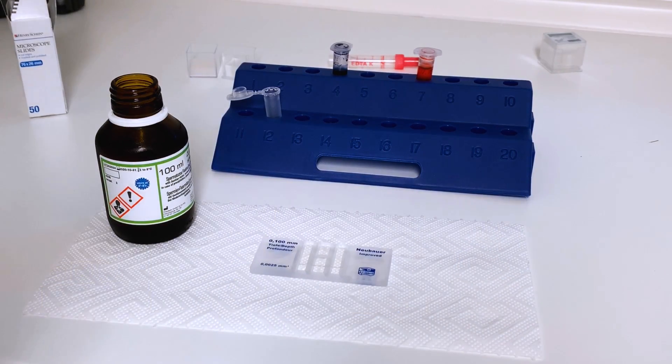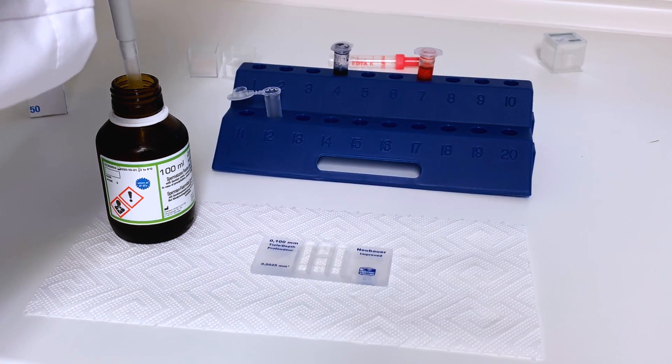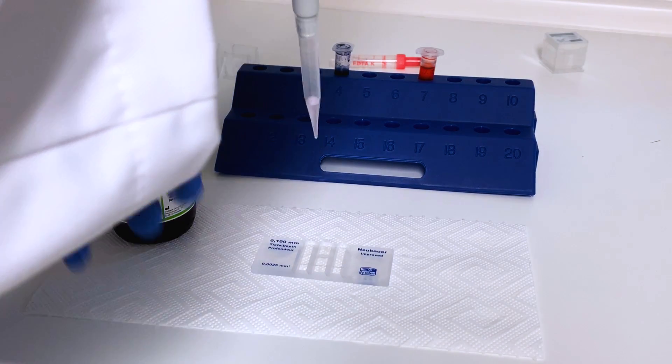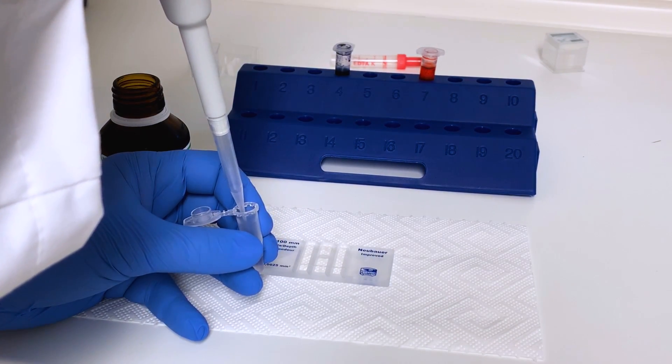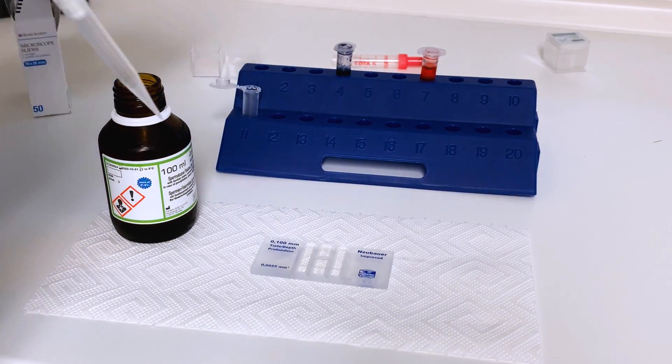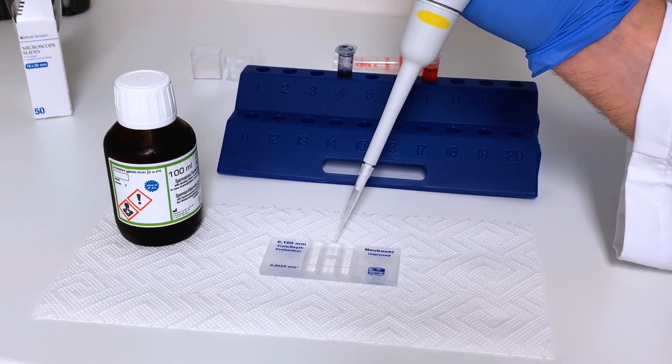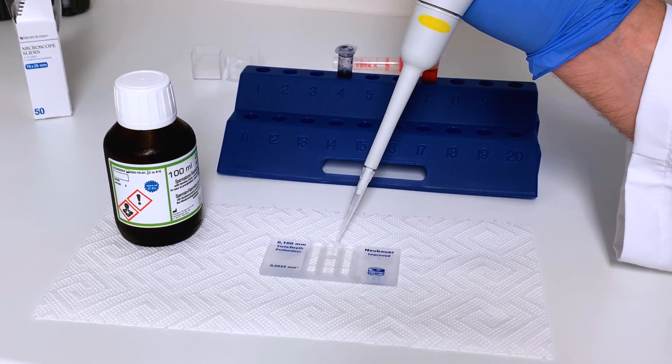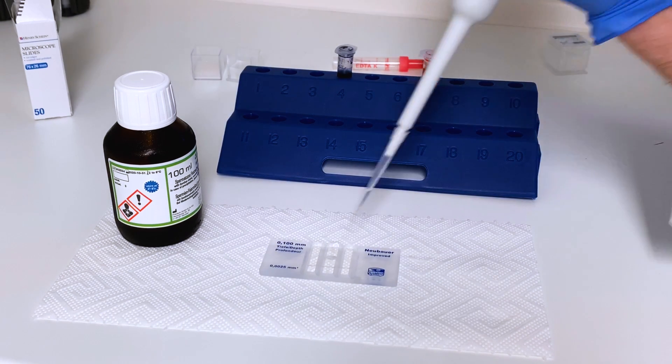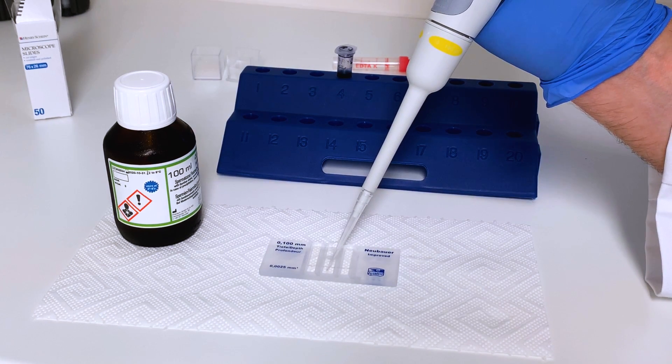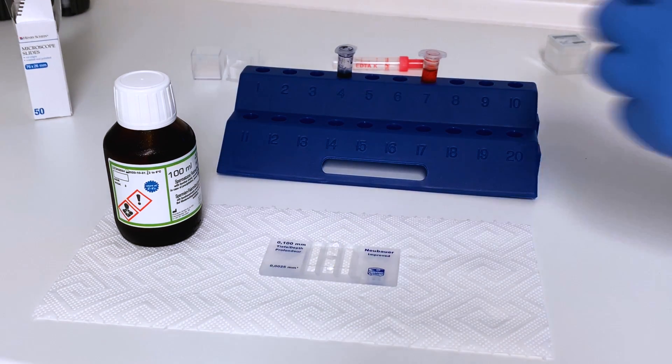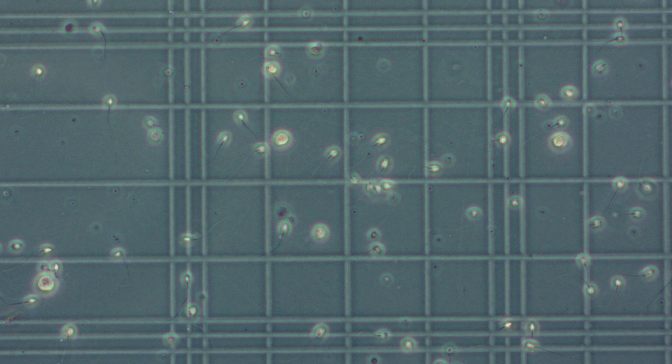Before starting the counting process I have to dilute the ejaculate and this is done by using a special buffer, a so-called WHO buffer which is placed in this cup together with the ejaculate. After having given it a good shake I am placing a cover slide onto the chamber and with a pipette I'm putting two small drops at each side of the slide. The adhesion forces will then pull the solution into the chamber and the sperm will distribute along these small grids that I was mentioning.